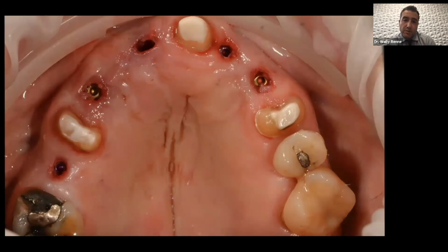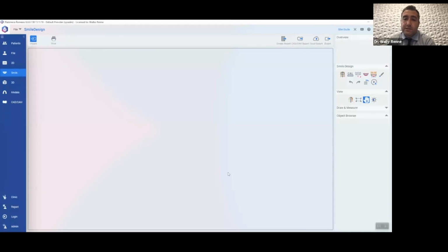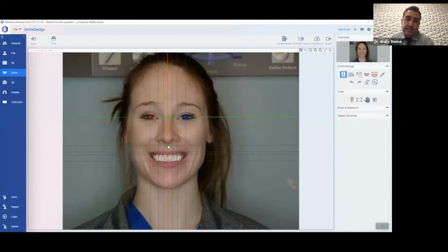So we have torque, so now we could extract those remaining 3 teeth there that were prepped, which were holding on the provisional restoration from before. And this is our 3D printed, basically out of PMMA, NextDent, crown and bridge, nano hybrid material, and it's almost identical to the smile design which we originally did. So this is the first case I really used smile design on, and it made me a believer. So now I use smile design on every case.